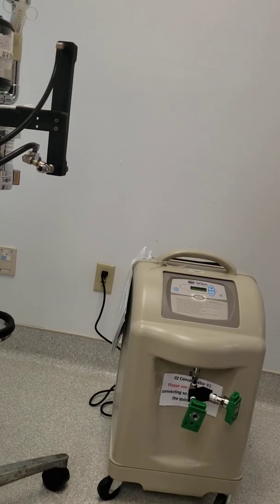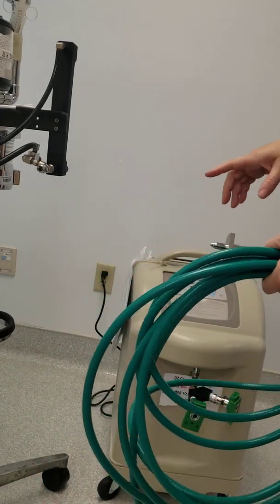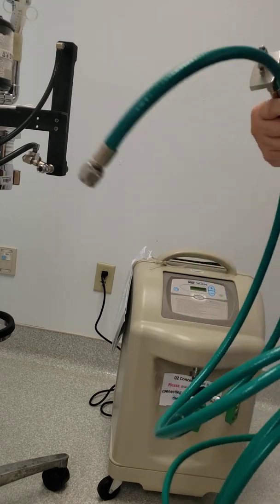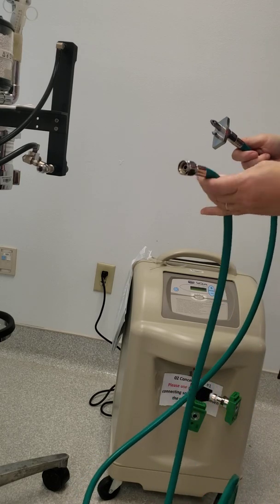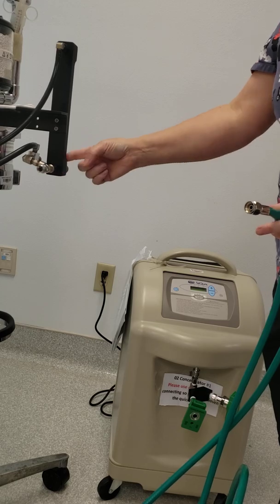Here's a quick video to show you how you need to hook your anesthetic machine up to the oxygen concentrator. You're going to need an oxygen line that has both ends: the quick release and the little screw end. The little screw end is going to attach to your flow meter.